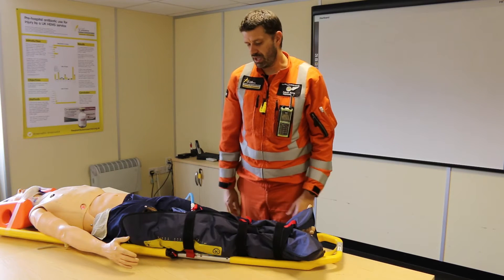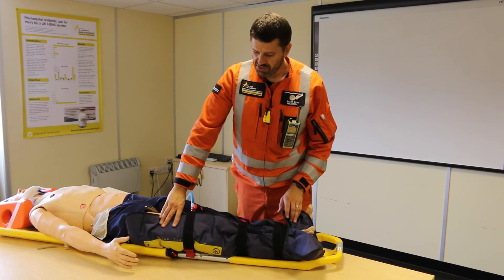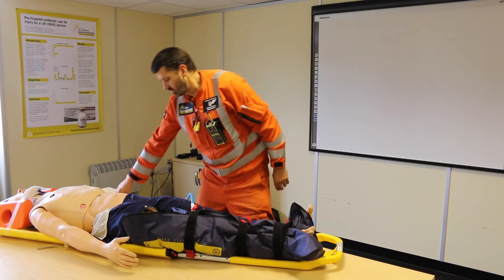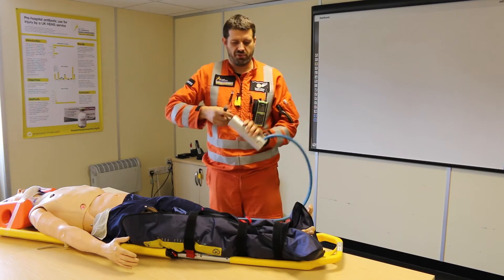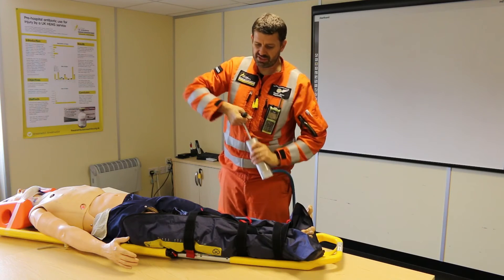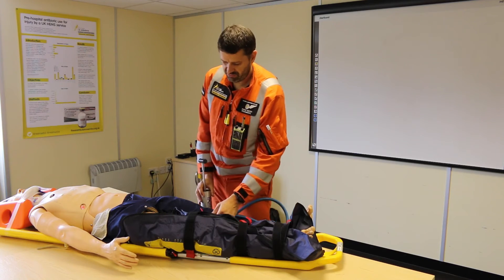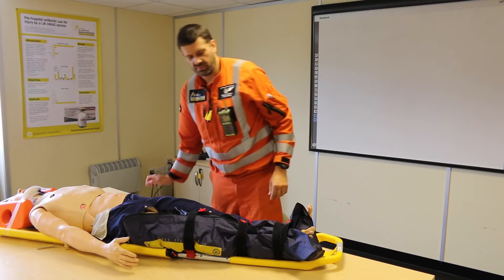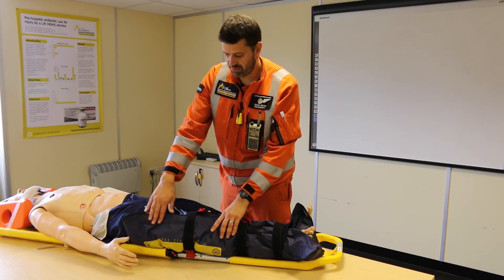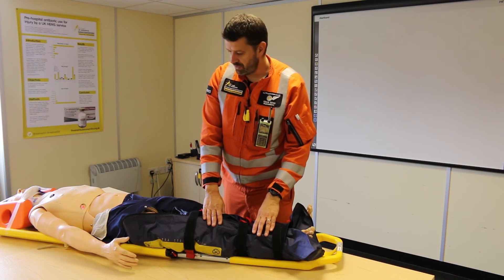And that's really important for what we do prior to effectively managing and transporting our patients. So the splint's in position. We've got some straps here that I've just put on loosely to secure it. We attach our pump and it extracts the air. As it extracts the air, we can keep an eye on everything, make sure everything's in position. Release the valve. And it's now nice and solid. From this position, we can then tighten these straps if needs be, check for the circulation further down the limb, and then we're ready to go.